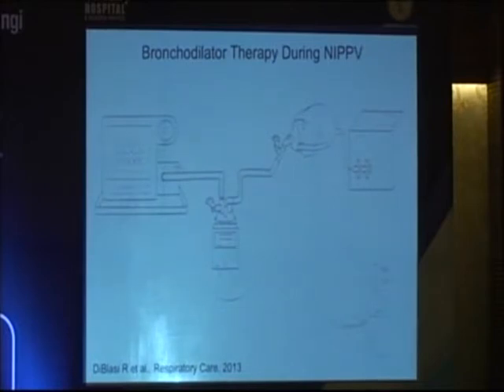But I've always wondered, well, where should we be putting the nebulizer with this system? And this is a complicated system because it uses a single circuit. And the way that a patient exhales through this circuit is you have a little integrated leak valve that eliminates CO2. So, do we put that before the leak or after the leak? Should we put it by the humidifier?